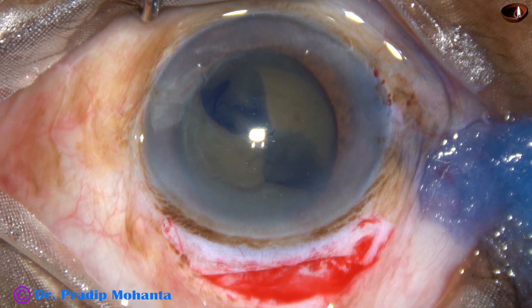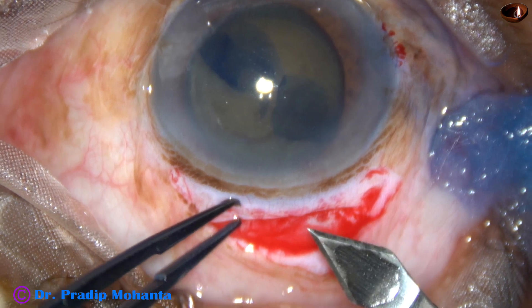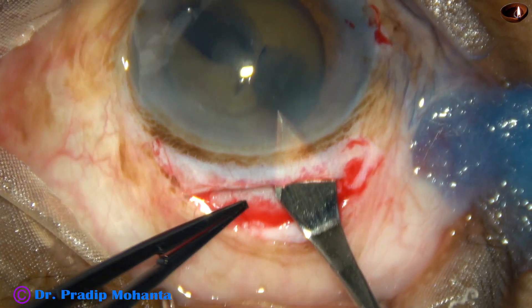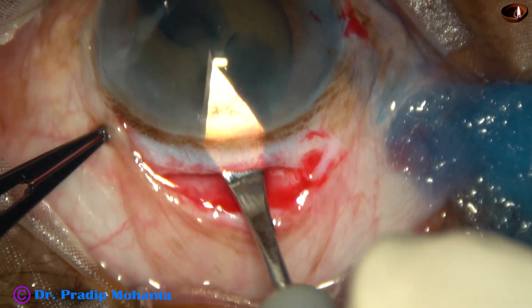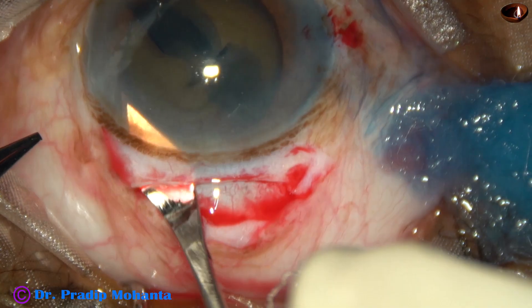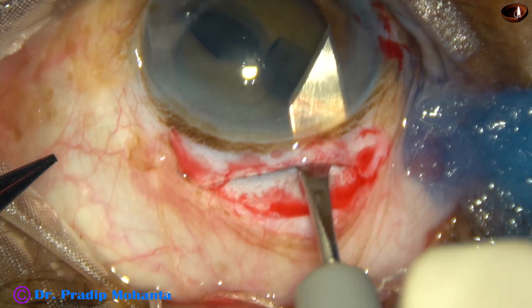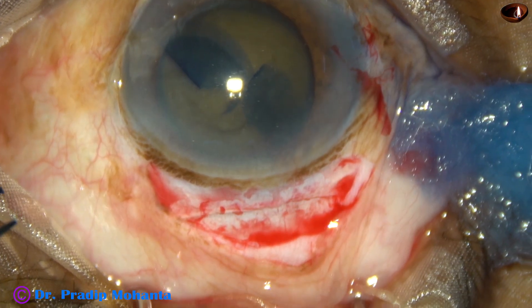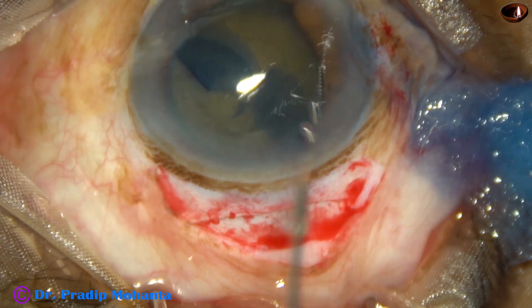Now the tunnel is being opened. Go to the extreme anterior part and then go into the anterior chamber, and cut when you go forward. This is going to be a self-sealing wound — no suture will be required.